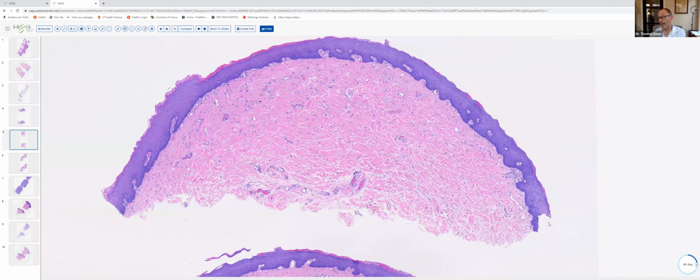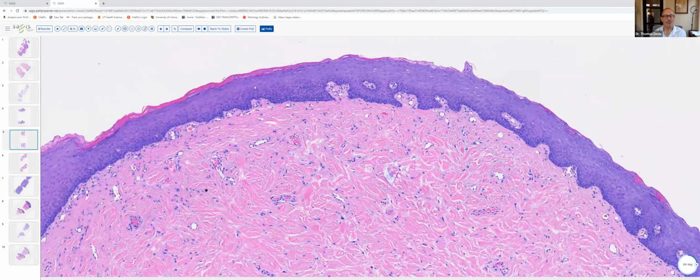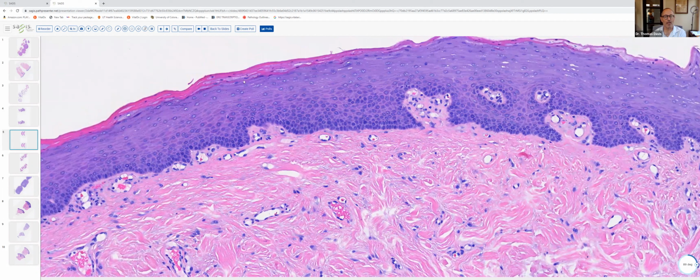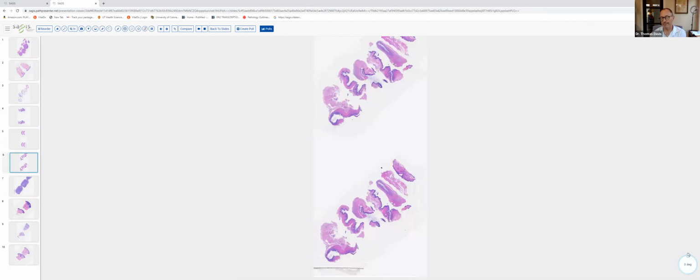A lot of times they'll develop at sites of trauma. And so sometimes these are referred to as bite fibromas as well. And this is a very characteristic histologic appearance. And again, it's important to recognize mucosal epithelium, stratified squamous, no granular layer, parakeratotic stratum corneum, and some vacuolization or swelling of the cells in the upper spinous layer. Moving on to case 6.